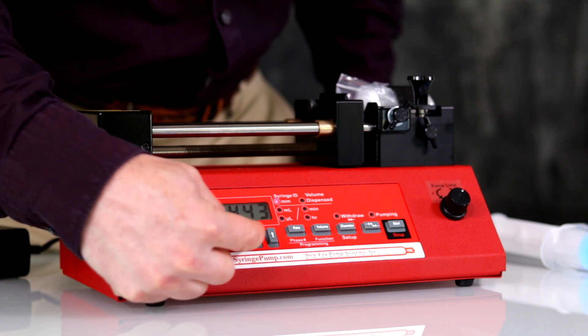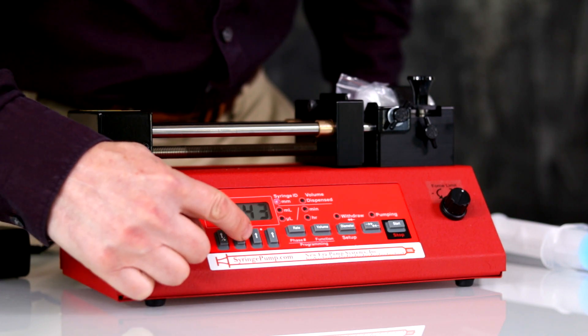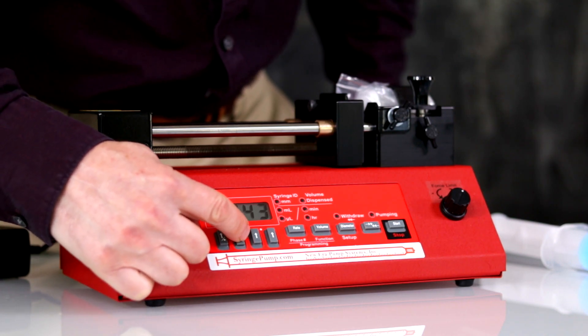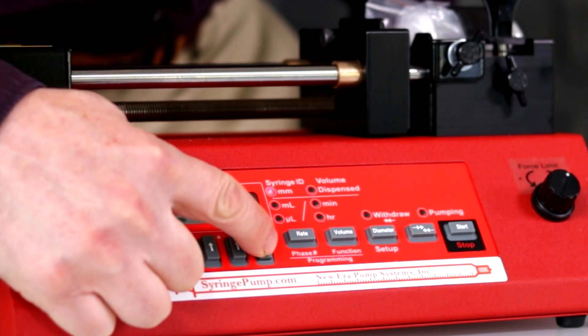The syringe loaded has a diameter of 29.2 millimeters. You can find this information in the user manual. Press and hold the key to quickly increment the digits. When entered, the display will blink and the LED will stop blinking.